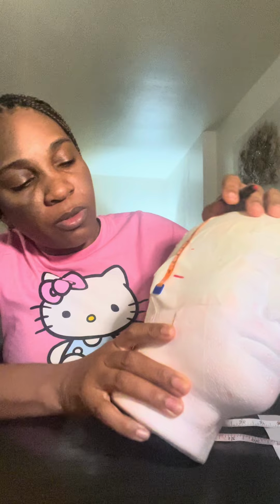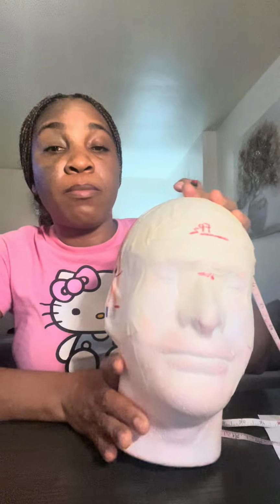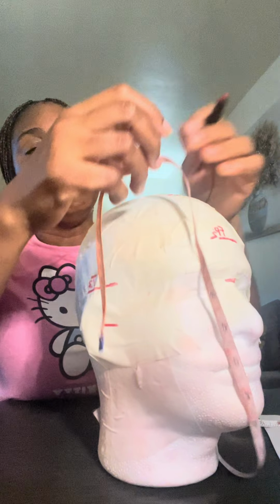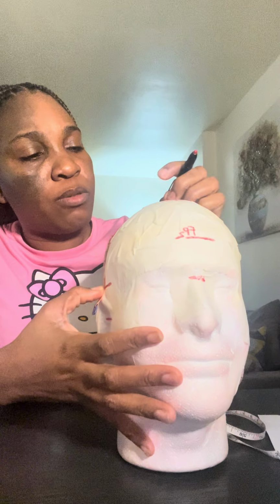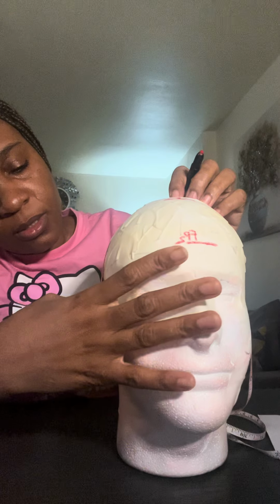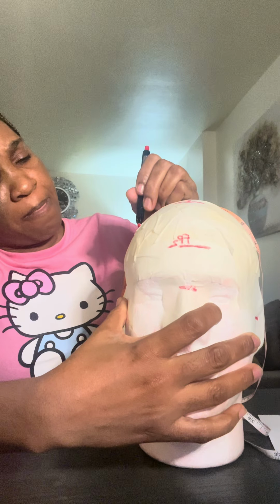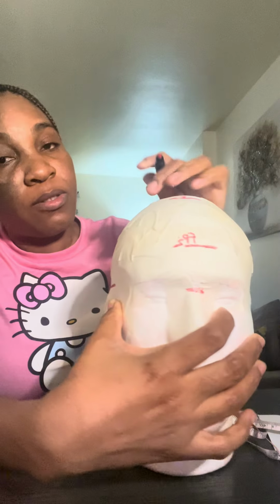Okay, and this is going to be my T3. Okay, my T3. So putting my 0 mark on my T3, going by 20%, which is 6.8. This mark is going to be my C3.